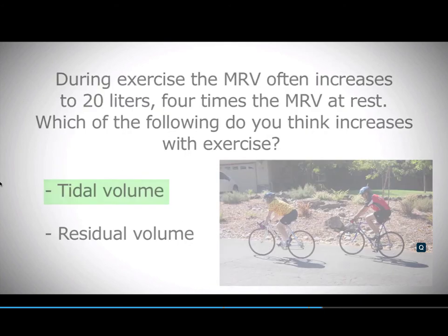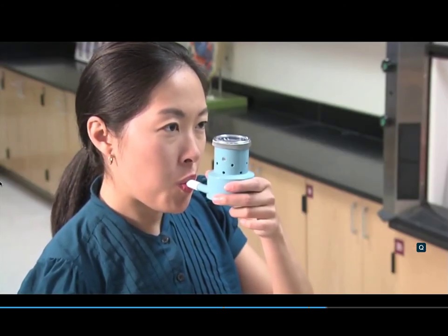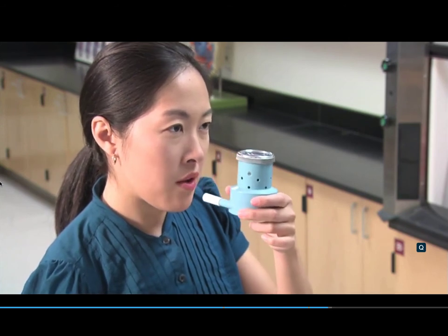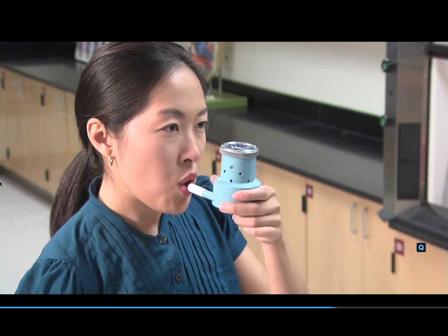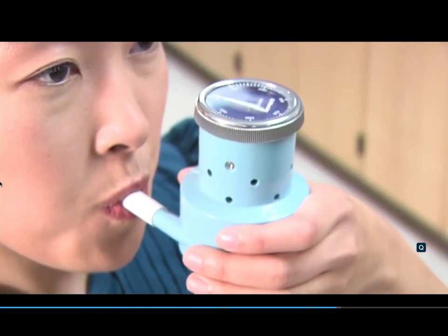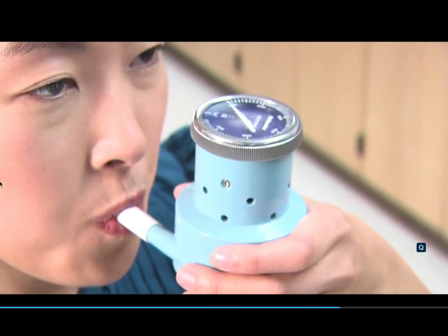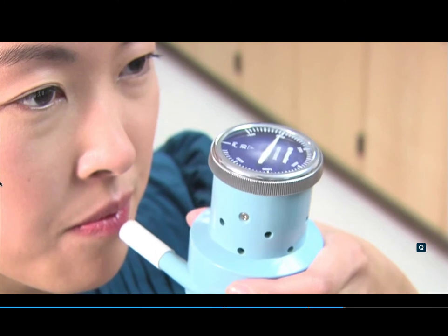The expiratory reserve volume is measured by exhaling as much as possible into the spirometer after a normal, quiet exhalation. It's not necessary to blow forcefully, just evenly and completely. The spirometer can measure only exhaled air volumes, but we can measure the vital capacity and, from that, calculate the inspiratory reserve volume.